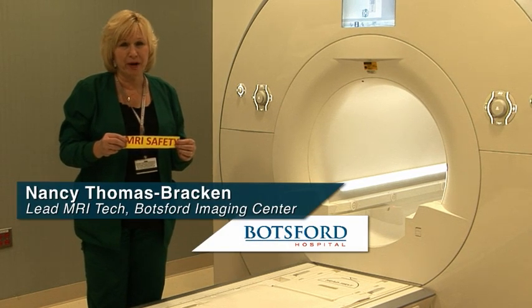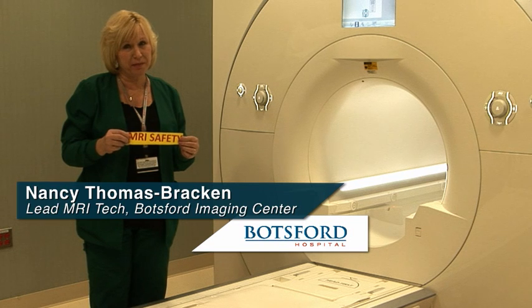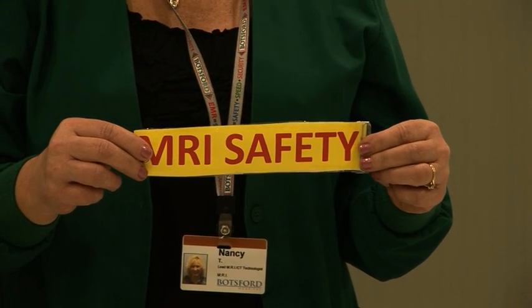Patient screening is very important in MRI. We as technologists decide what metal can and cannot go into the magnet. Here is a demonstration of our MRI safety sign that has paper clips in it.